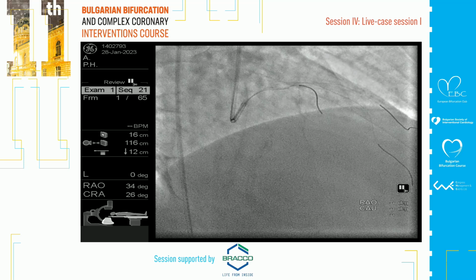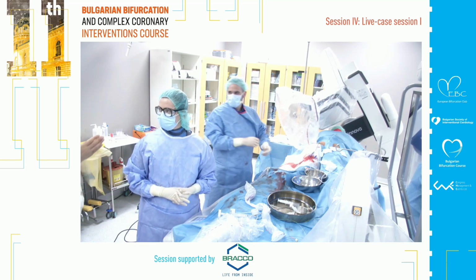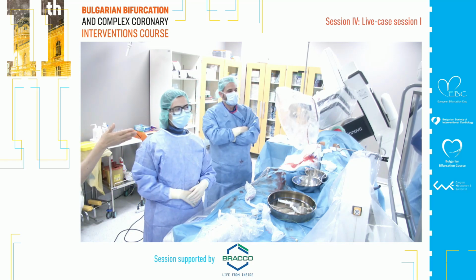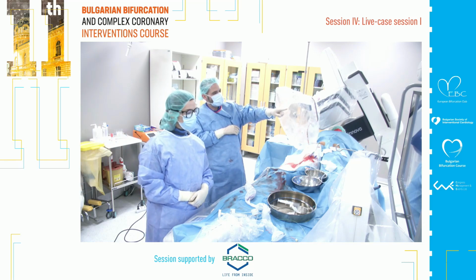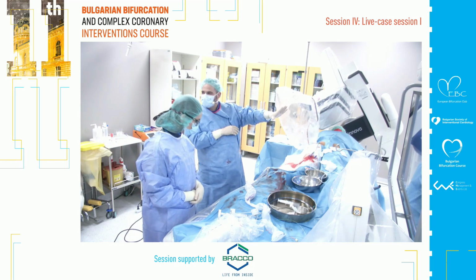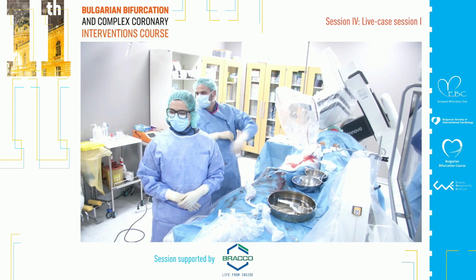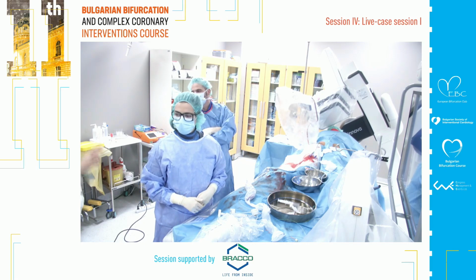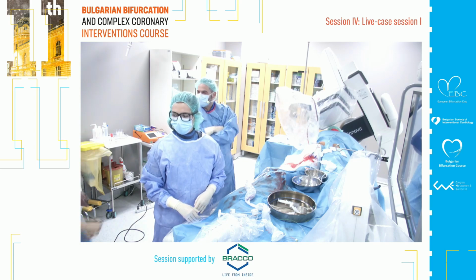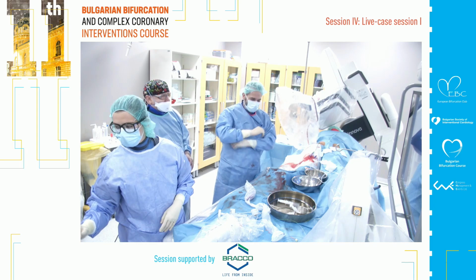The diagonal is 2.5. The IVUS shows down to 10 millimeters proximal to the diagonal there is a landing zone that angiographically appears to be quite healthy. I think you need a POT proximal to it. We do a POT, and then if the diagonal is good, we remove the wire and concentrate on the other.